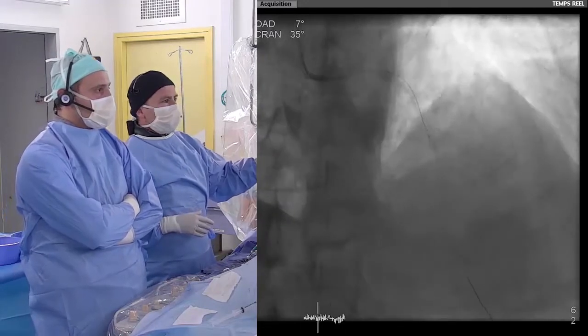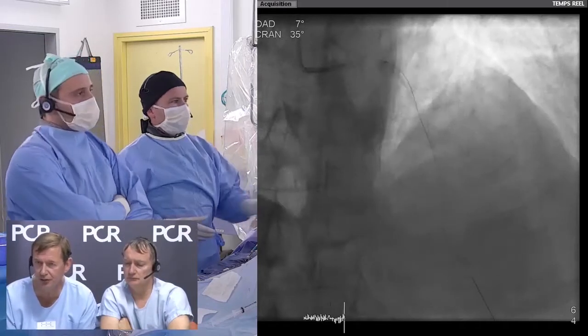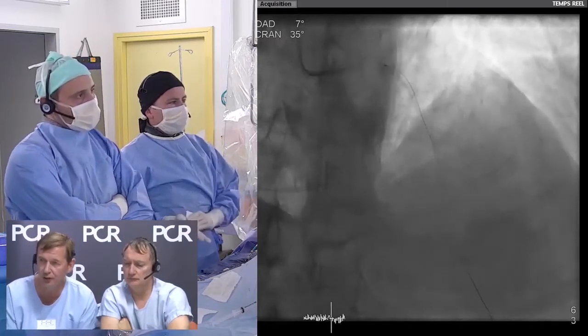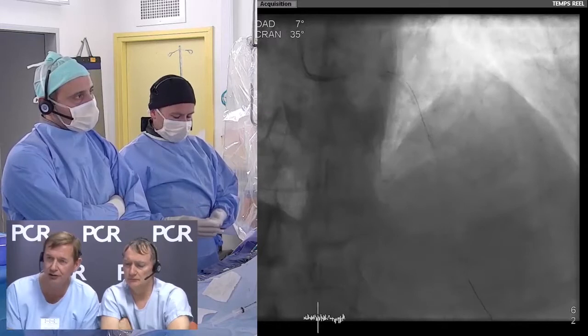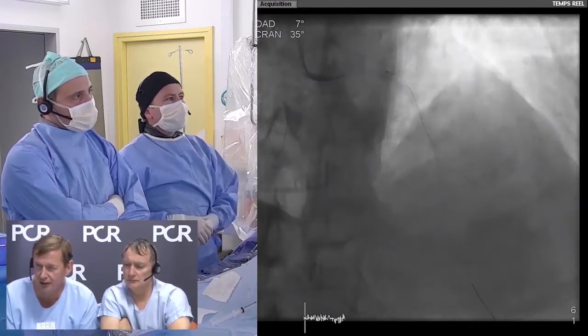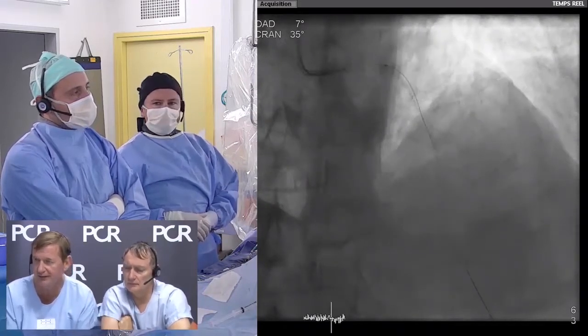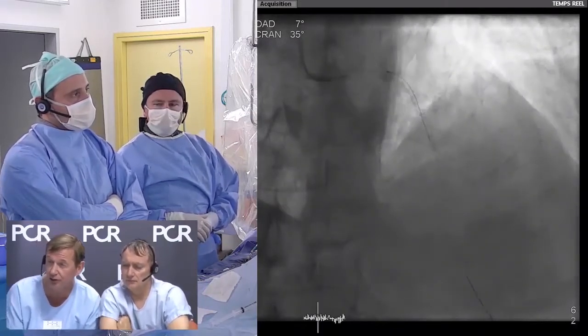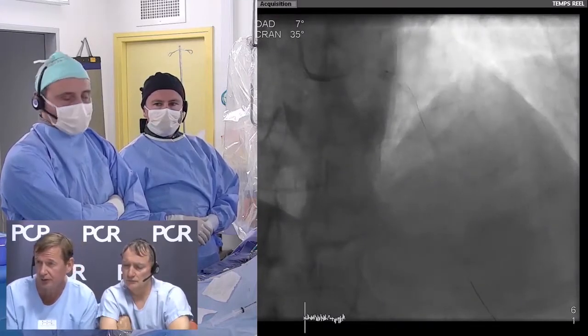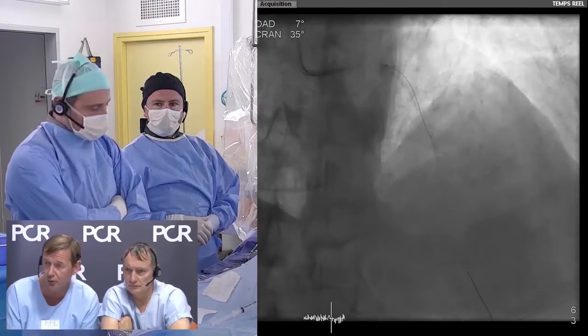So it's quite common to find a lot of epicardial calcium in these elderly patients, but not always with a sort of obstructive lesion in the mid-course. In this particular case, because there's obstruction at the ostium left main, ostium LAD, extensive calcium with some stenosis perhaps severe in the middle, is that why you went ahead and did imaging rather than perhaps feel your way with a balloon?